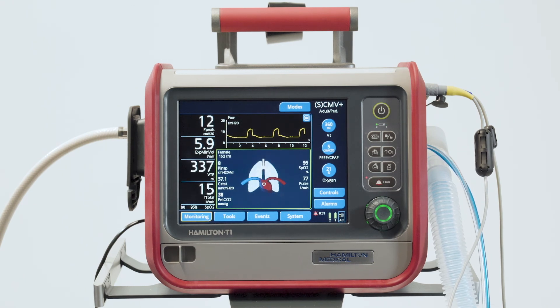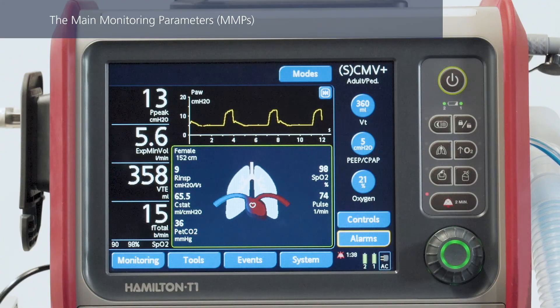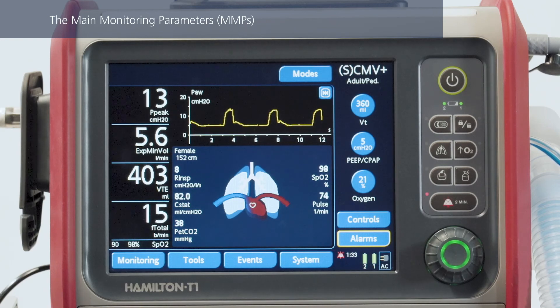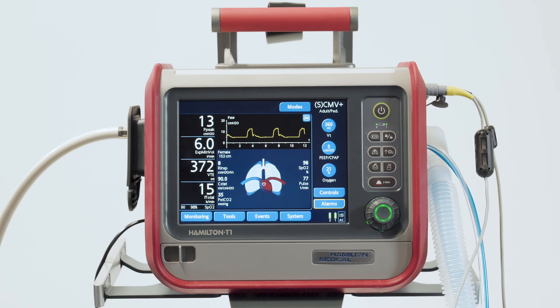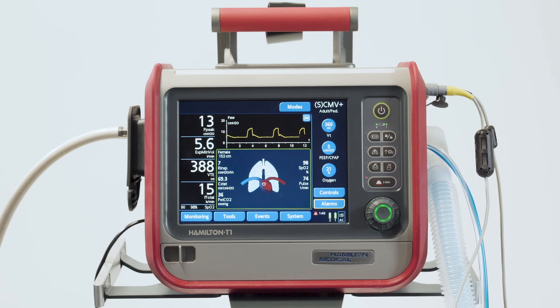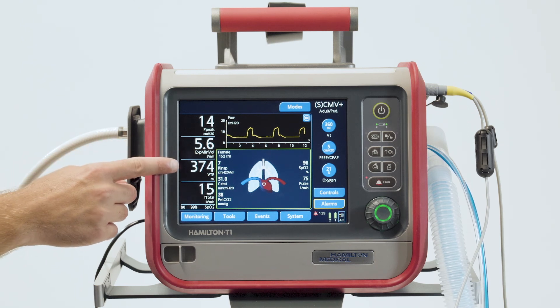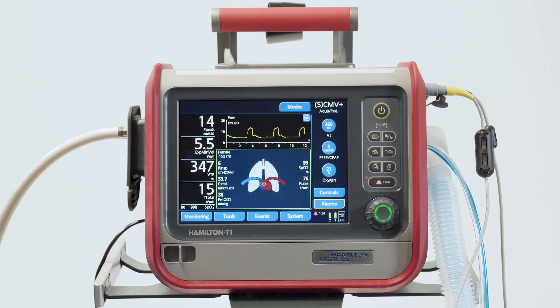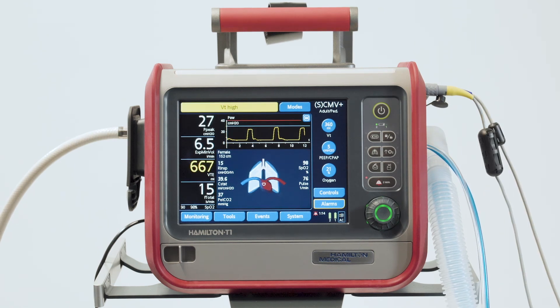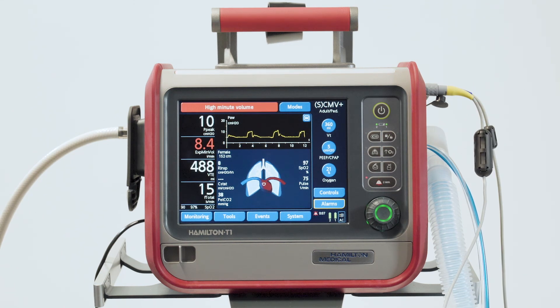Now let's have a look in more detail at how to access patient data and configure the screen layout on your Hamilton T1. The four numerical parameters shown on the left side are the main monitoring parameters. For each of these parameters, you can see the current value, the name, and the unit. Any of the monitored parameters can be displayed here — you can choose which ones to display and the order they should appear in. The parameters shown here — peak pressure, expiratory minute volume, tidal volume, and total respiratory rate — are our factory defaults. Normally, these numerical parameters are white, but if they are affected by an alarm condition, their color will change. For a medium priority alarm, the parameter will be displayed in yellow, and for a high priority alarm, in red. When the alarm resets, the corresponding MMP turns white again.